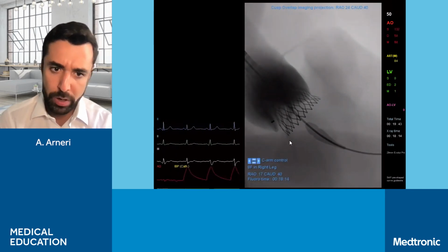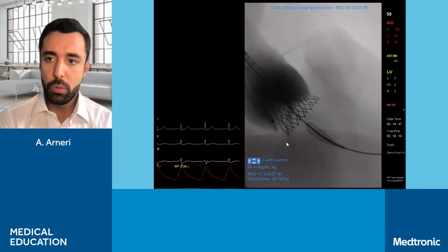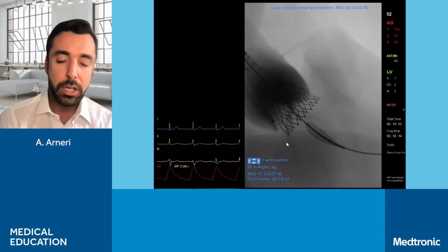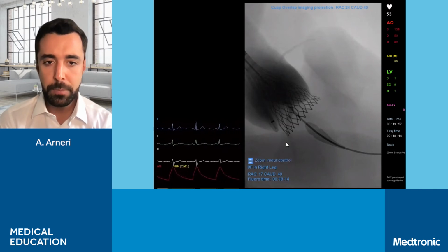So now we're a bit higher. We're probably at 4 millimeter. So we like this position a bit better than before. We could have been a bit higher, but for the sake of time, we're not going to recapture again. We can do our final release.